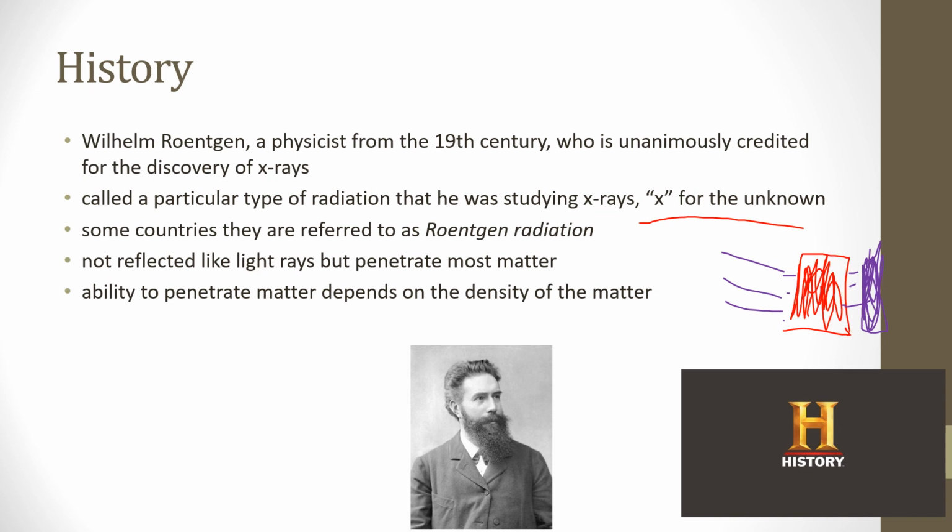Now, if I have a similar situation and I have something see-through, you know, the X-rays going through it, let's say it's a hollow brick instead of just a pure brick. It's a hollow brick, and so more X-rays will be able to make their way through and go to the cassette, right? And then that's going to appear darker because less X-rays were absorbed. Over here, we had greater absorption of X-rays, and therefore you're not going to see it as dark.